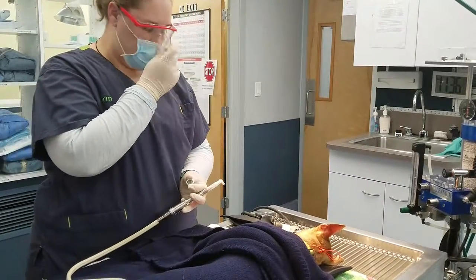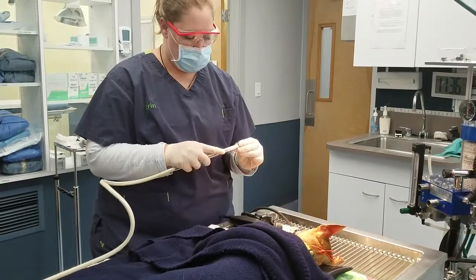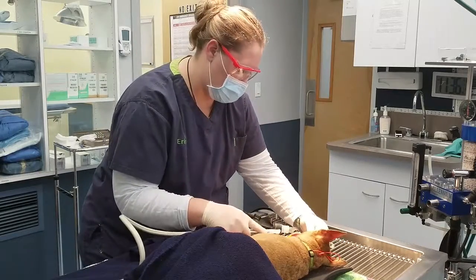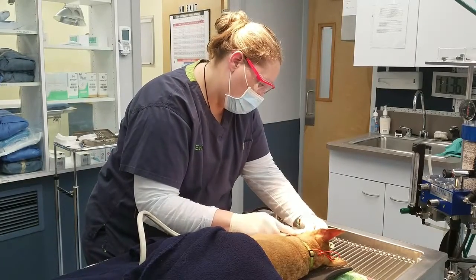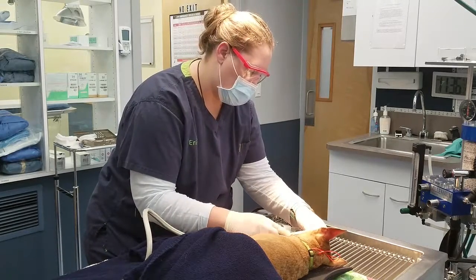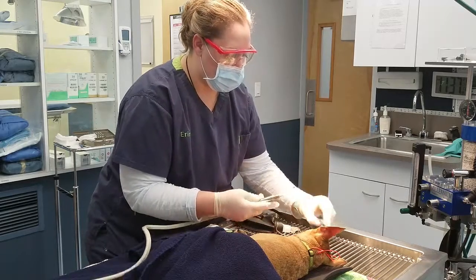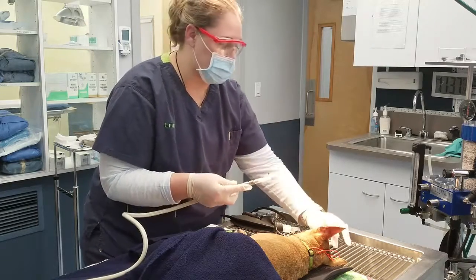I'm going to put my mask back on. You want to make sure you're refilling the paste in your Prophy cup as often as needed, okay? So if there's no paste in there, it's not doing you any good.